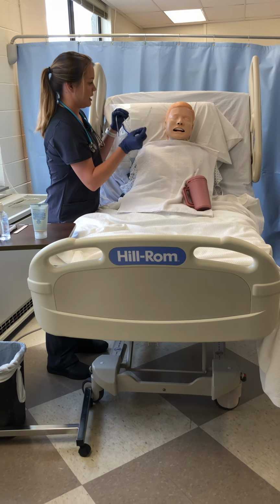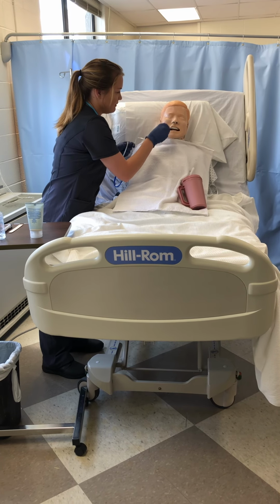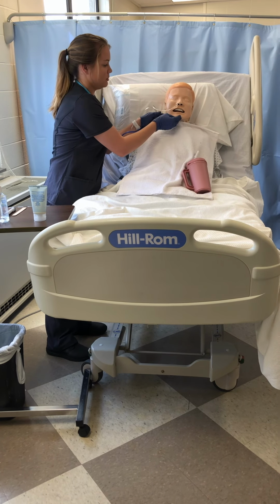Alright, Mr. Bob, I want to have you take some deep breaths. I'm going to insert it, okay? 1, 2, 3. I'm going to be inserting it, having him take deep breaths. He's going to be coughing. And I'm going to have his head tilted back when I insert it.